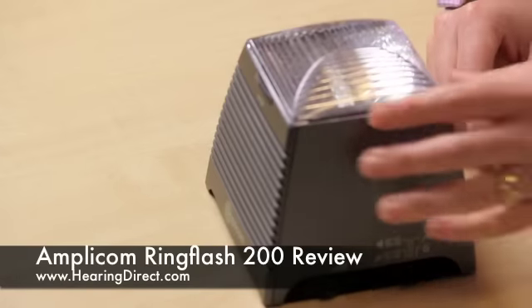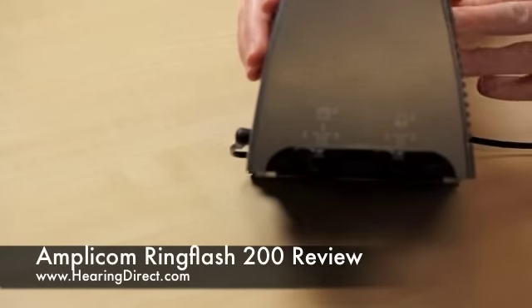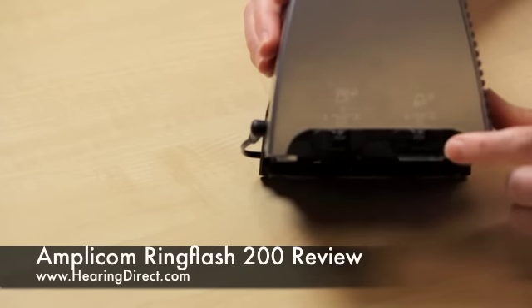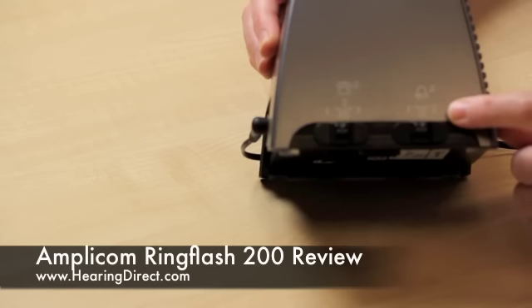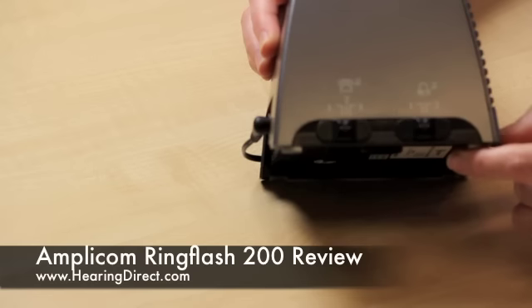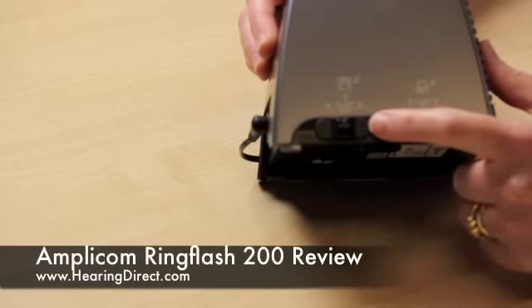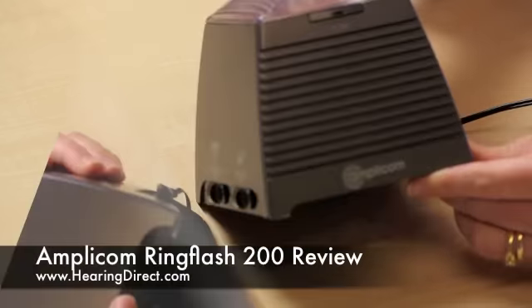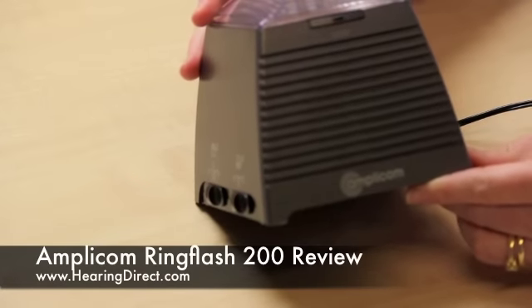If we turn it around to the other side, there are two further switches to be aware of. This one indicates the tone that can be chosen for the doorbell — both options are fairly typical ding-dongs, either a low tone or a higher one. For the phone, you can also choose various melodies to alert you. The last button to be aware of is the stop button, which simply needs to be pressed to stop the light.